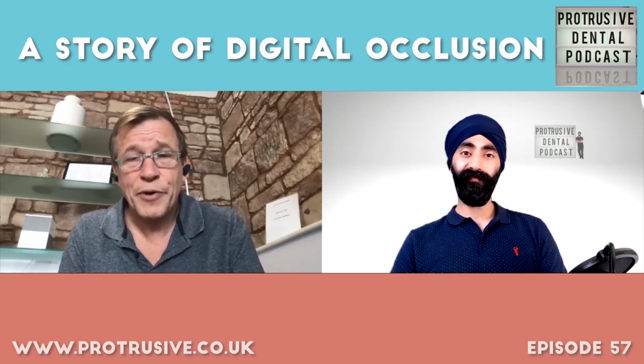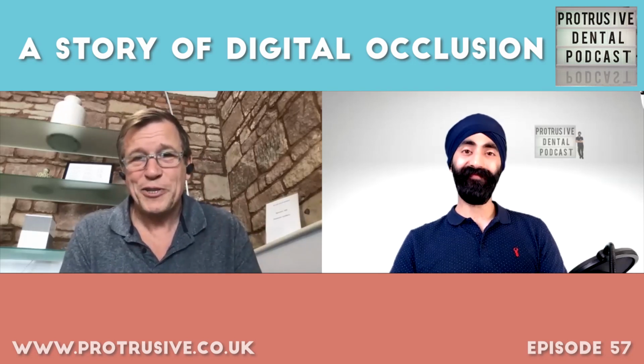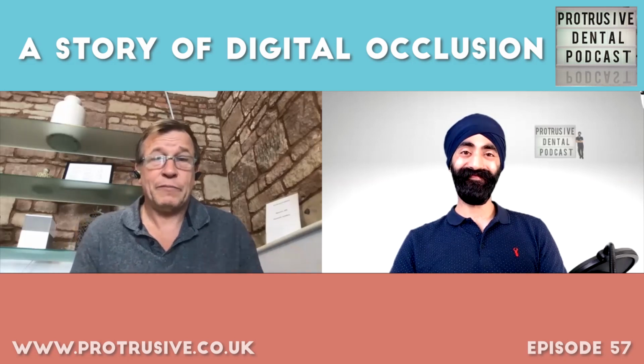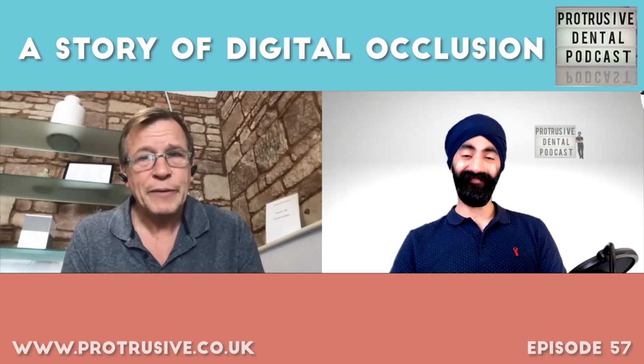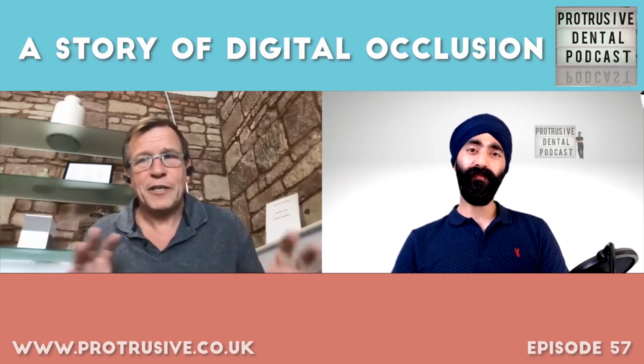Nothing was worse than an impression going to a lab only to get a phone call to say, that impression you took is not the best. Whereas now, if we wanted to, the technician could look at it straight away and go, yeah, that looks great, let's carry on. So it was a great communication tool. So there were so many bits and pieces that were coming together.